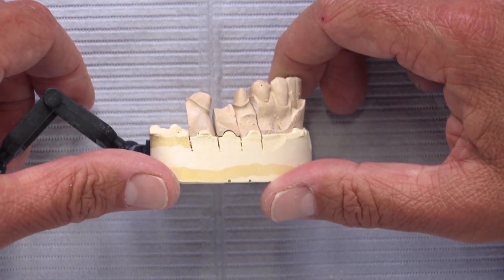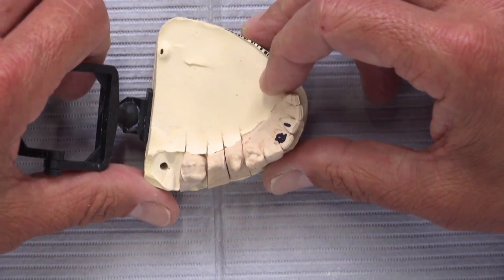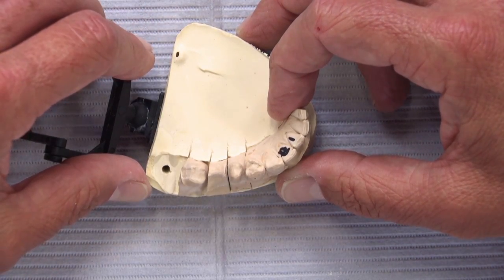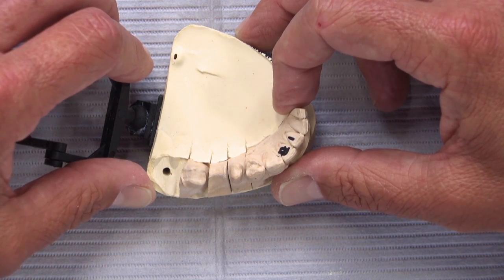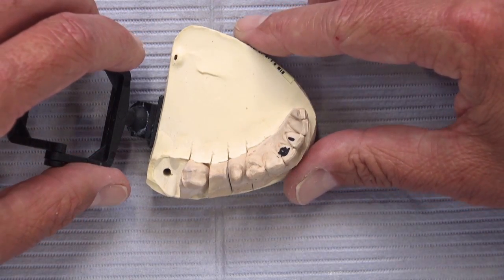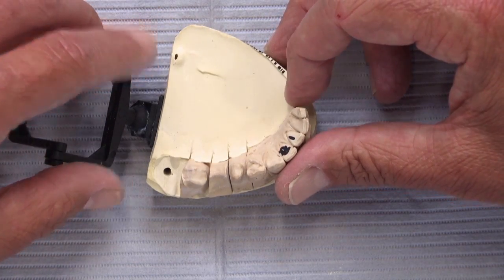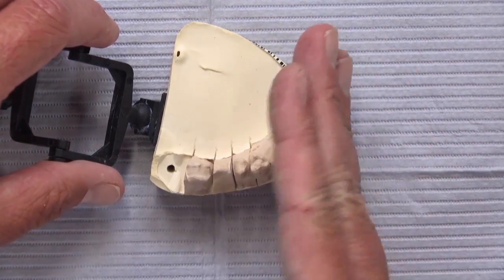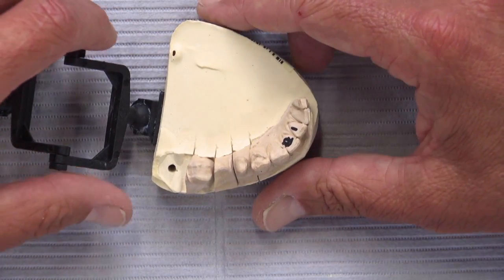We can even stay on the line and watch the dentist take the digital impression to make sure they've captured all the information we need. The patient is still there, still anesthetized — this isn't getting them back at another appointment. It's right at that moment, and it's been a fantastic way to help dentists. It's really like having a live laboratory technician in your office with x-ray vision who can calculate undercuts in real time.